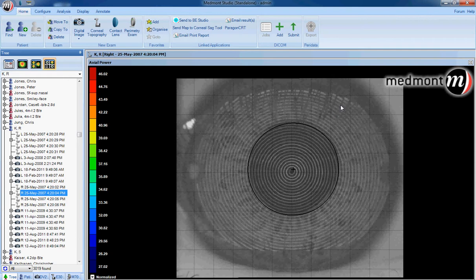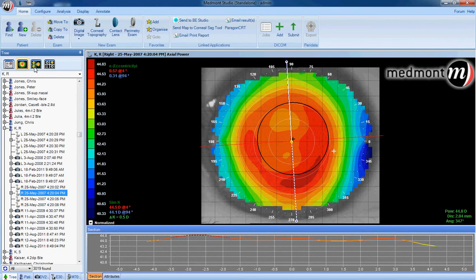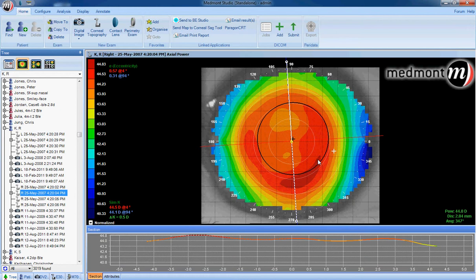What we hope to achieve is a placido reflection very well centered to the visible iris border or limbus. Take four images per eye and choose from the four the image that has the largest fissure area, the least lid and lashes in the way, has the smoothest colorized contours, and also has the largest surface area of analysis.